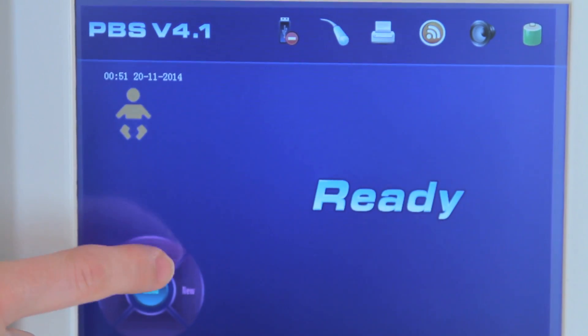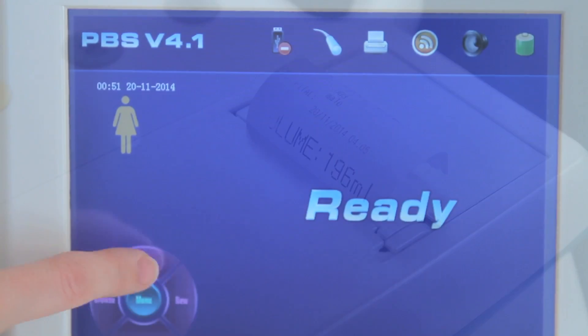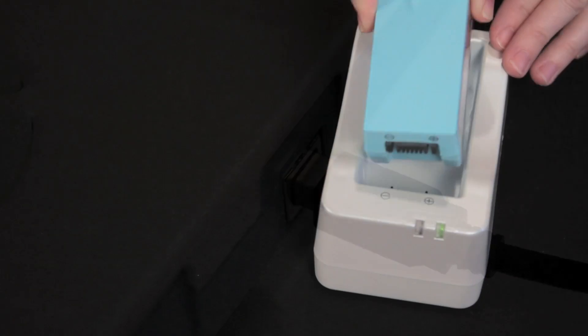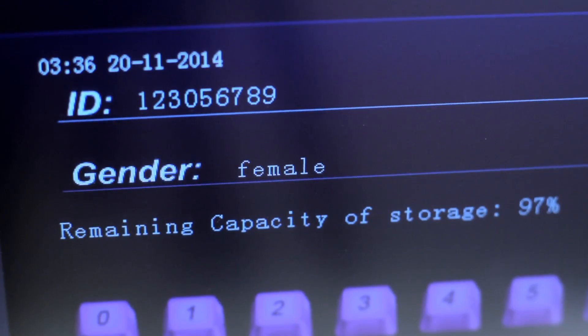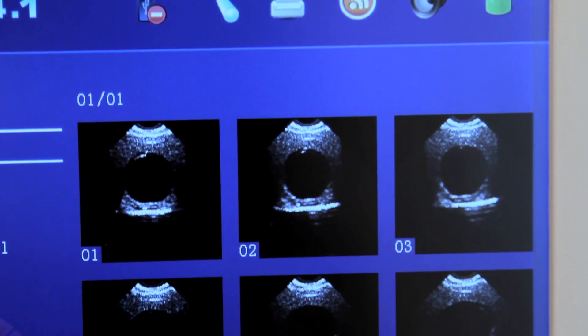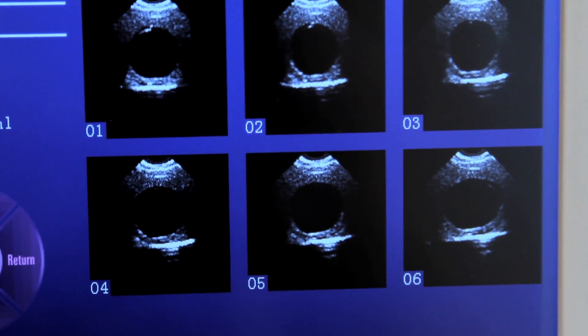RosyScan comes equipped with a color LED touchscreen, an onboard printer, rugged rolling stand, USB output and storage, and rechargeable battery. It can store up to 100 cases with patient ID, continuously run for 4 hours giving you 100 scans, and can display up to 24 images.